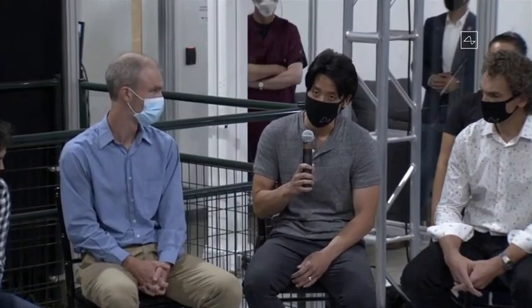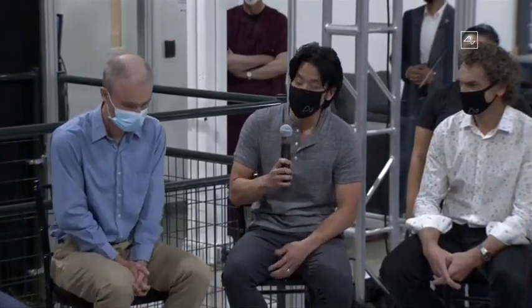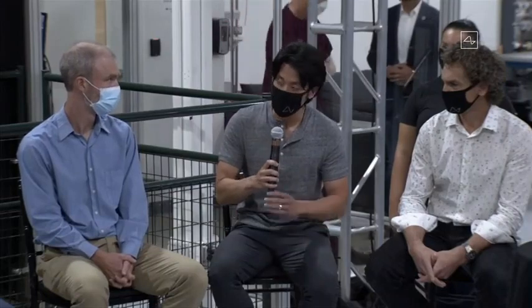Okay, so let's see. DJ, what do you work on? Yes, my name is DJ Seo. I'm leading implant electronics development, like chip design. And a chip designer, engineer. The prototype that we were showing has 1,024 channels. All of those channels are capable of recording and also stimulating. And in terms of recording, as Paul mentioned, we do have on-chip algorithms to do a level of compression and extracting the signals of interest, in this case, neural spikes. Sure. And those things are happening at a much faster speed than your brain is even processing that information.